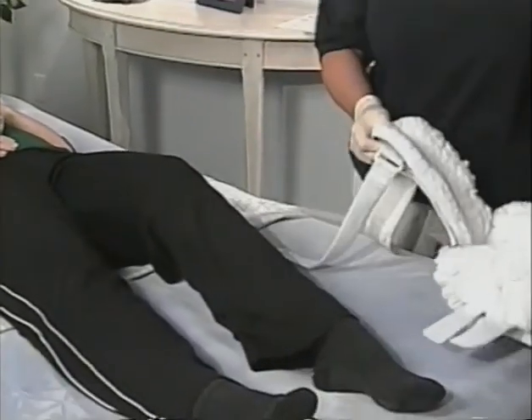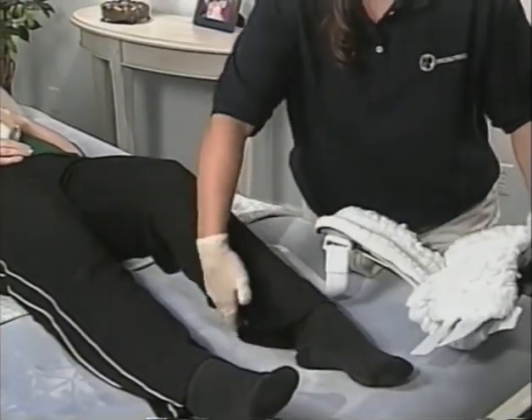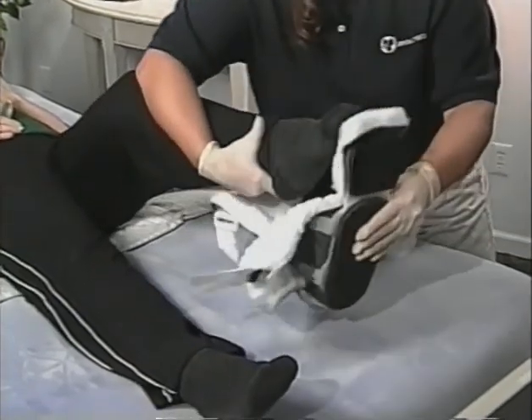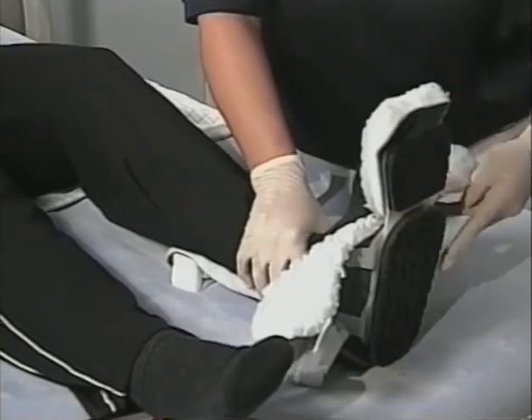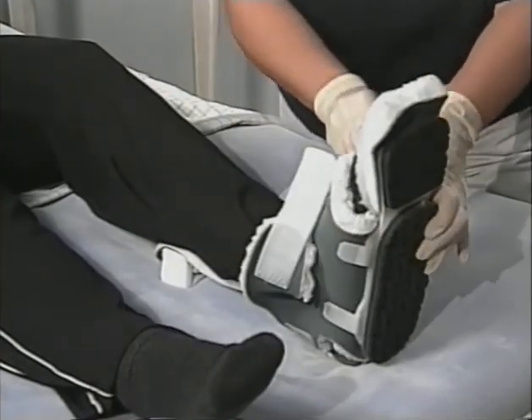When applying the Prafo or ankle-foot orthosis, bend the knee and take care to place the heel securely into the orthotic. Fasten the straps.